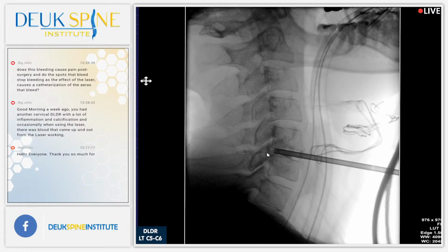Right where the tip of the tube is. Yes, right there. Perfect. Henry, can you get that? Already did. All right, so you should be getting several pictures here, Henry, in sequence.